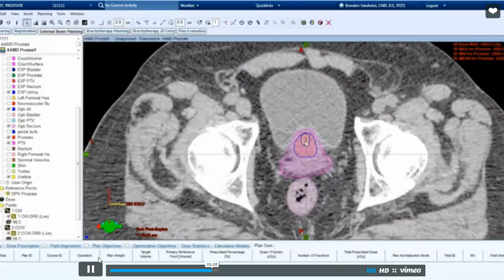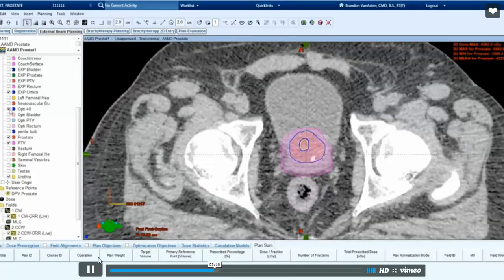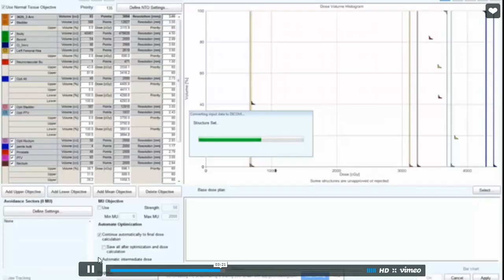So if I throw the dose on again and just turn these planning structures off, you can kind of see that big donut in there, which is pretty nice. So there's a little bit of horns down here around the rectum, which obviously you'll get if you're really tugging on this. So what was your first score? Do you remember when you submitted?